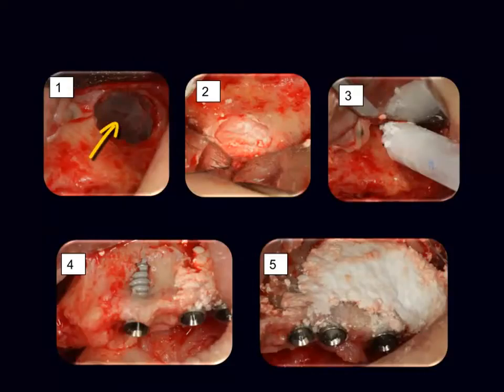Sinus cavity and lateral augmentation. When a longer duration of space maintaining is required, BONDBOND may be used as a composite graft. For example, in cases of lateral augmentation and sinus cavities augmentations. The composite graft consists of BONDBOND mixed with the dentist's preferable bone graft granules.